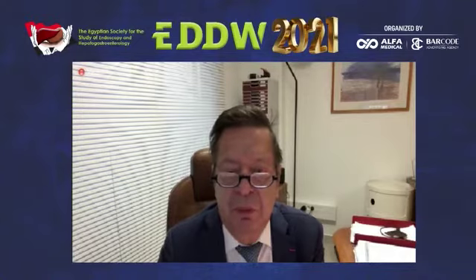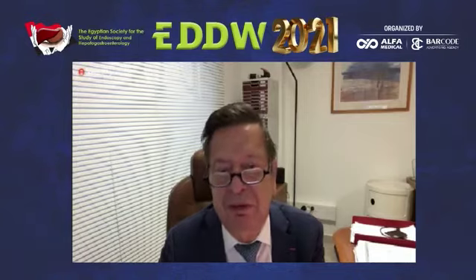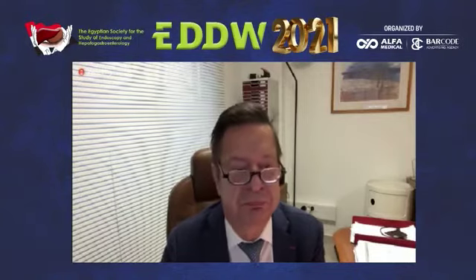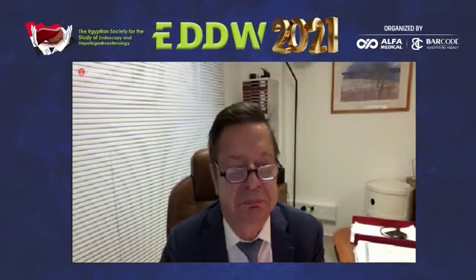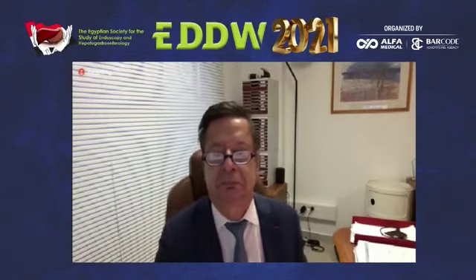Because when you use LCI or NBI, the artificial intelligence sometimes is more difficult to use. That's why it's better to use it with white light endoscopy. But it's very different from one tool to another. I will explain later on this morning. Thank you, sir.